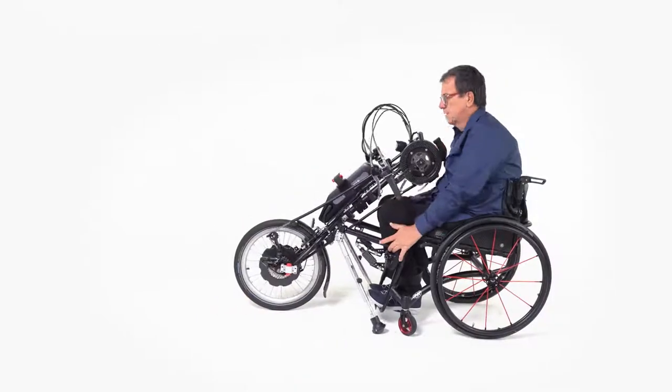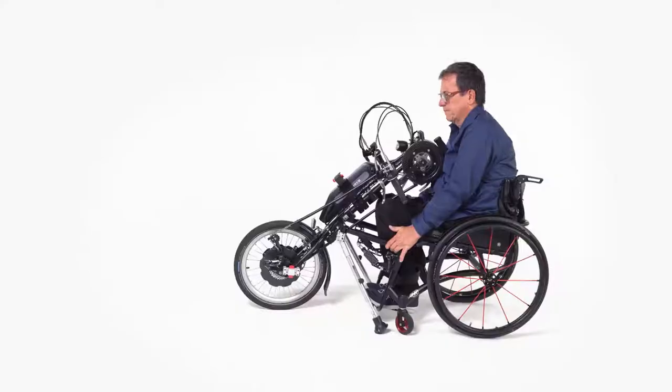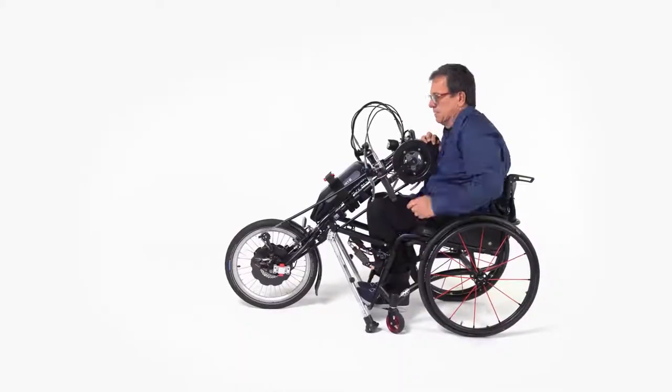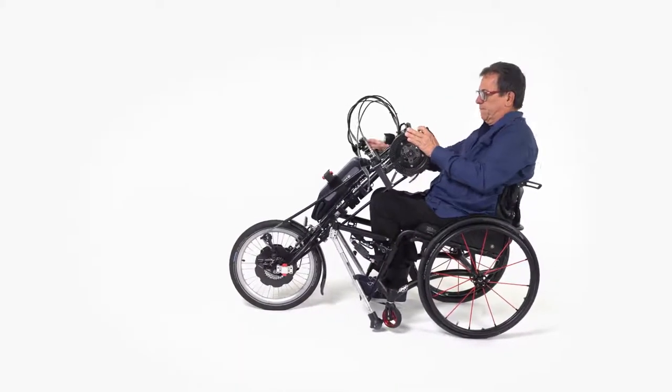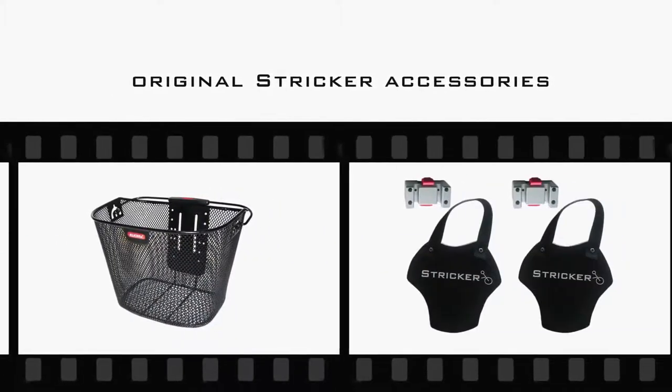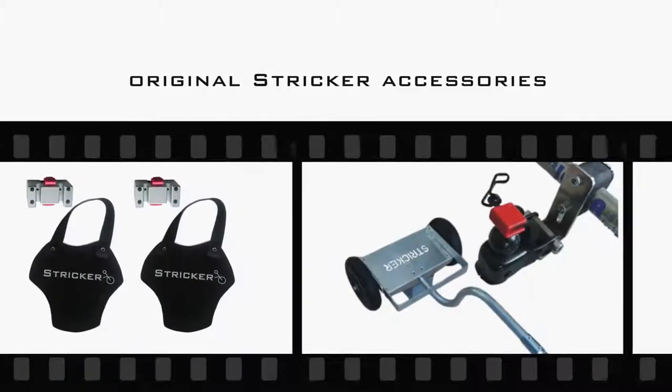Now you are able to couple your handbike or power assist device to your wheelchair in a few simple movements. Nothing stands in the way of your ride. Increase your riding fun even more with versatile and practical original Stryker accessories.